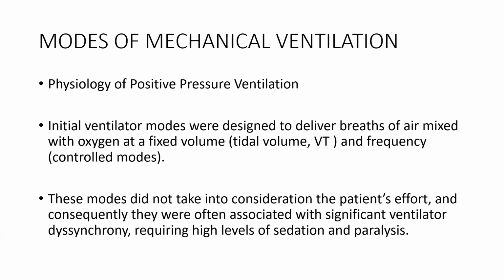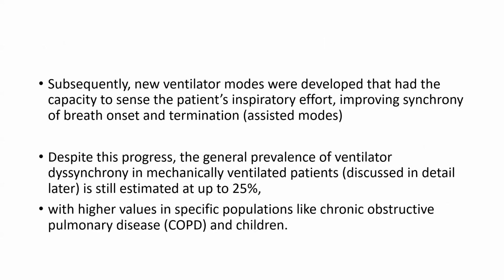Now, what is the physiology of positive pressure ventilation? Initial ventilator modes were designed to deliver breaths of air mixed with oxygen at a fixed volume, that is tidal volume, and frequency. These modes did not take into consideration the patient's effort, and consequently, they were often associated with significant ventilator dyssynchrony, requiring a high level of sedation and paralysis.